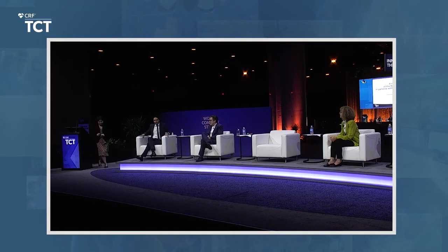Okay, so I'm going to put my vascular biology hat back on. I used to think that all calcified nodules were basically this jagged crystal that stuck out of the artery wall, the base of which was this massive plate of calcium. Now, I think it's like popcorn stuck in Jello, at least two-thirds. So you've got these little bits of calcium that are all separated, kind of connected with fibrous tissue. And when you do IVL and push it, it just gets pushed into the Jello.